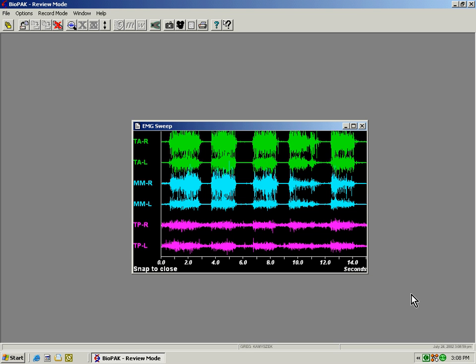Now we're going to cover the procedure for recording the length of a silent period. The silent period is a nociceptive response to the teeth coming together, to the teeth hitting together, that causes the muscles, typically temporalis and masseters, to shut down.